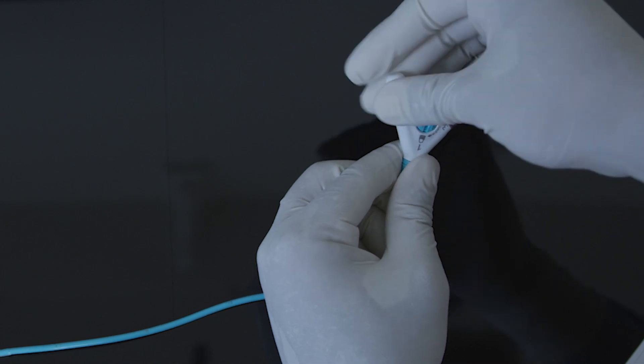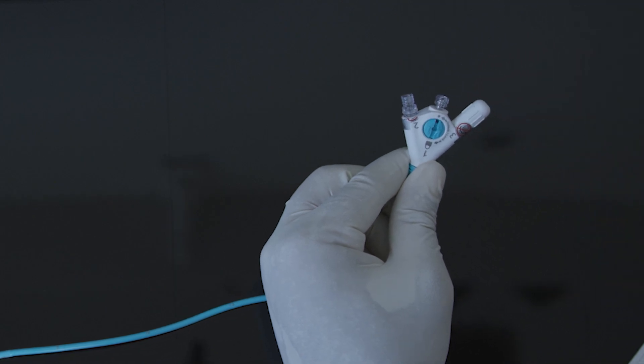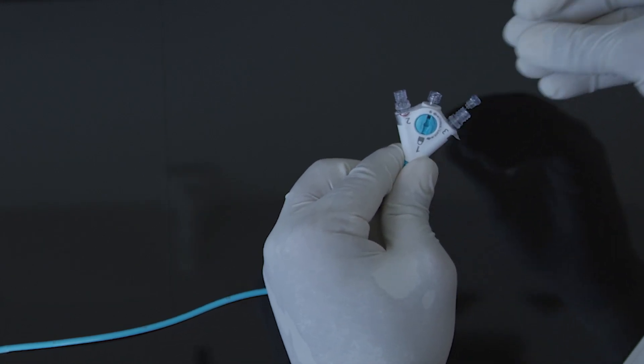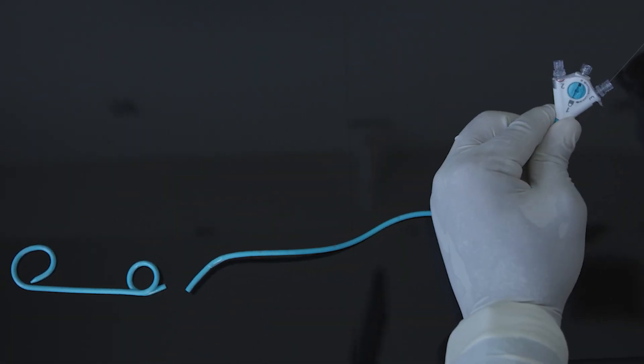Second, you would remove cap number 2 and pull out the suture. Completely remove it — it's about 2 feet. Thirdly, you would remove cap number 3 and pull the wire. You only have to pull it until you feel a soft stop — it's about an inch. Then you would see the stent deploy.